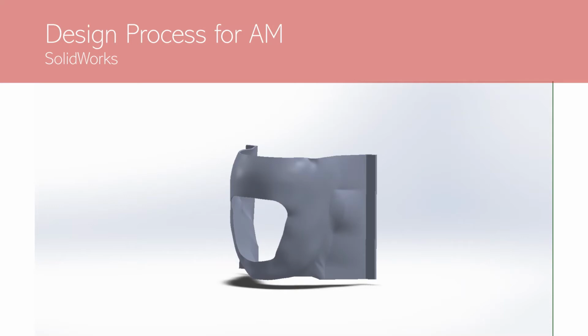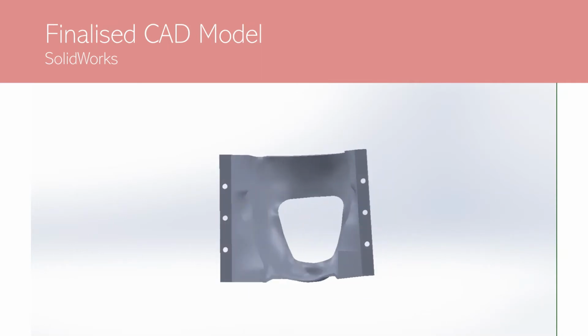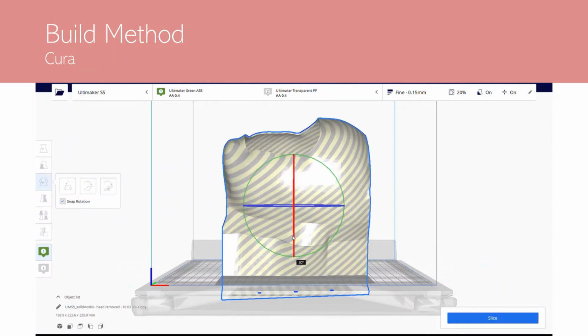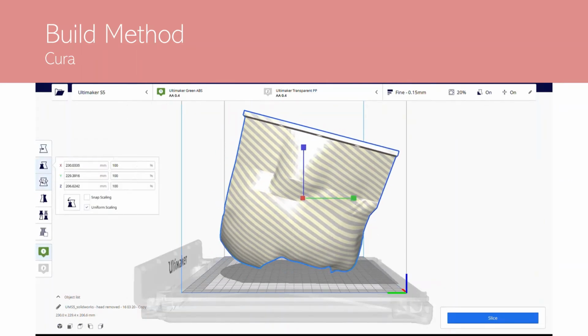Although subtractive and formative manufacturing methods were considered, additive manufacturing, or AM, was concluded to be the most appropriate, as low volumes of these custom-made masks are required, and it was the most suitable for use with 3D scanning and CAD. The material for each mask can also be kept to a minimum. From the 7 AM technologies, binder jetting, material extrusion, and powder bed fusion were the most promising, as they had previously been used in medical facilities.